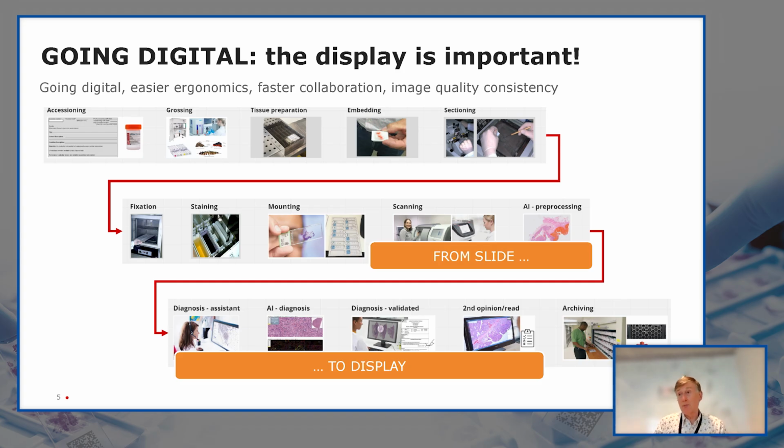You could say I'm working on my own desk. That's one thing, but you basically want to have consistency with other pathologists on their desk. So they also should have a decent display. If you do remote collaboration with a whole team, you all want to have image consistency over the different workspaces. So the display is of major importance here. And we are talking about image consistency.